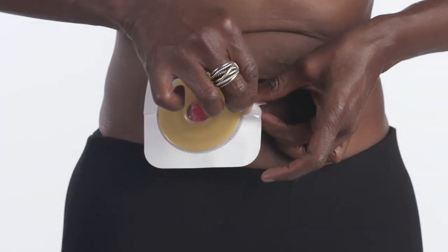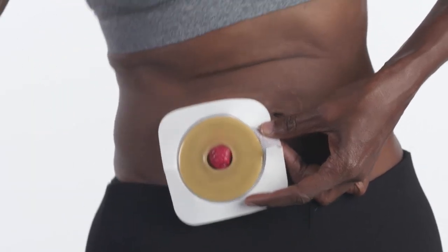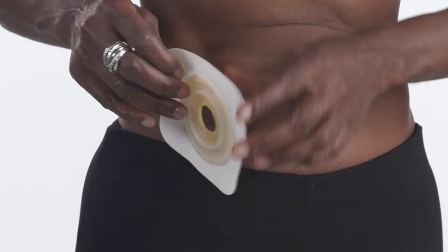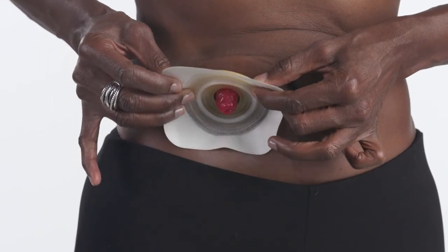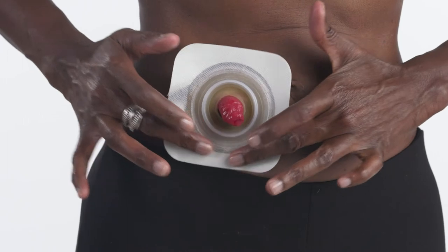Find the tab and remove the clear release liner from the back of the skin barrier. Immediately center the opening over your stoma and press the skin barrier into place. Push the molded roll of adhesive towards your stoma. The moldable part will rebound and turtleneck around your stoma, ensuring a close fit.